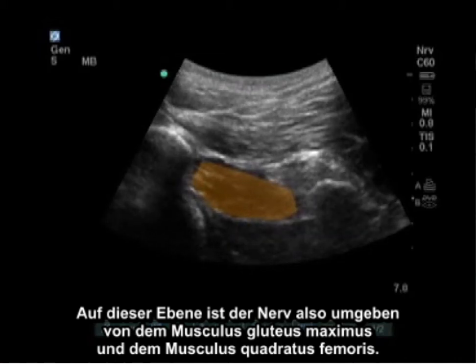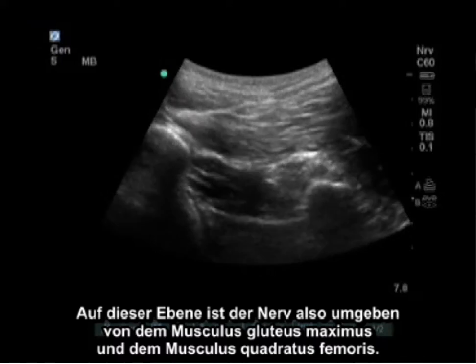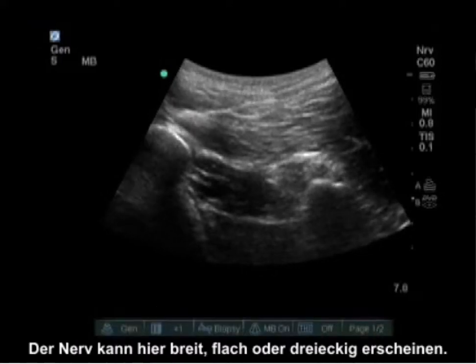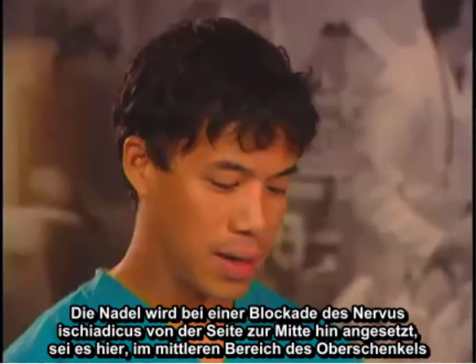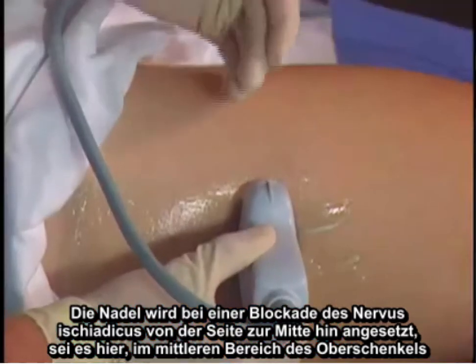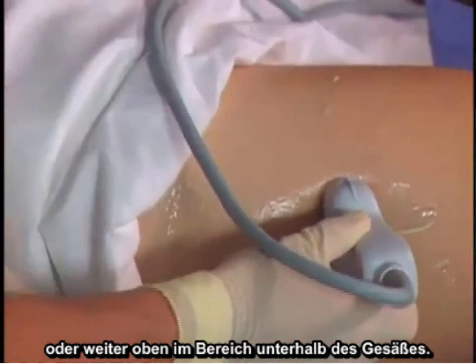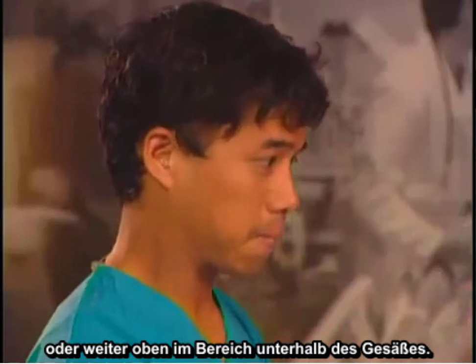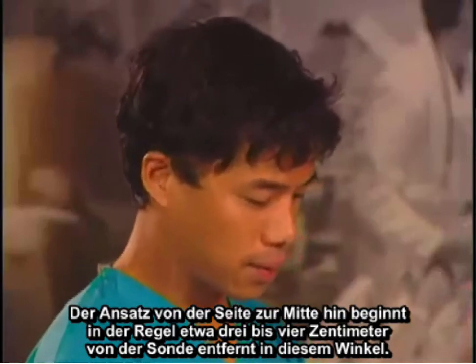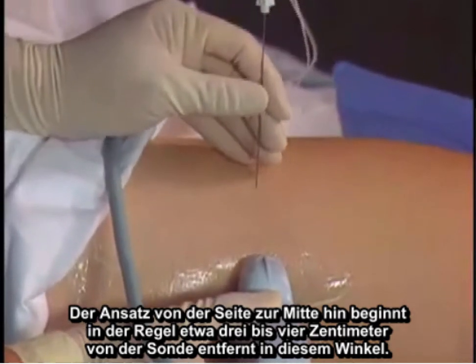At this level, the nerve is sandwiched between the gluteus maximus and the quadratus femoris. The nerve here can appear wide, flat, or triangular — it is not a circular structure like some people imagine. Needle approaches for the sciatic nerve block, whether at the mid-femoral region or higher up at the subgluteal region, are performed from a lateral to medial approach, typically starting three to four centimeters away from the probe.